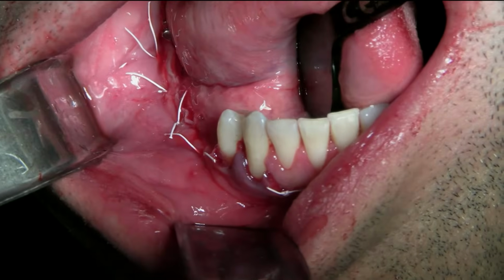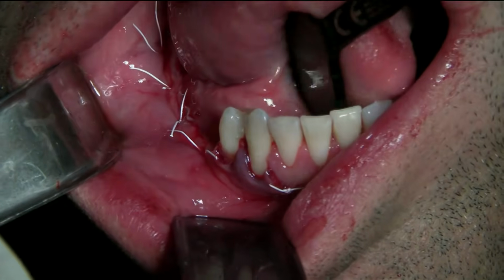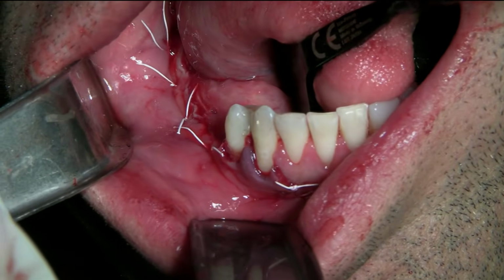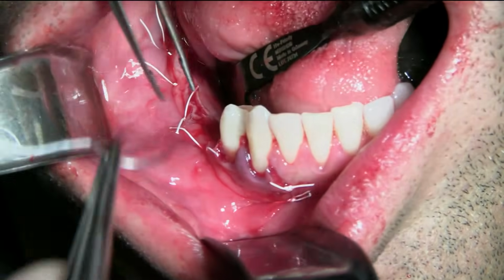And the goal with the single interrupted is to go with a very deep suture, so I can really get underneath the flap, underneath the incision margin. I need some light.